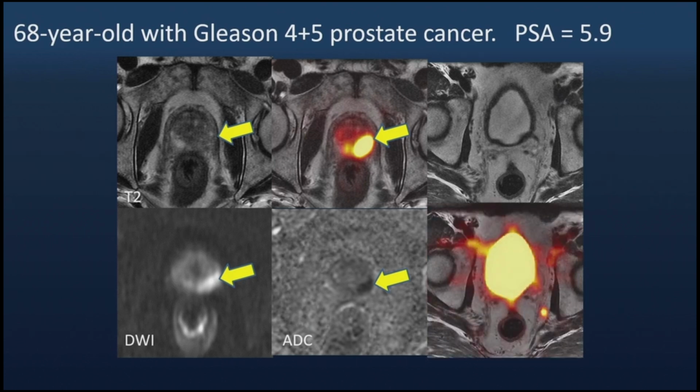Can you see it now? Literally screams to you. And one of the striking things when we were reading this is sometimes we don't even see the lymph node on anatomic imaging. We just feel like there's a little round dot. And it's probably referring to a lymph node because it's sandwiched right next to iliac vessels or right next to the psoas. We just have to be confident that is the location of the disease.